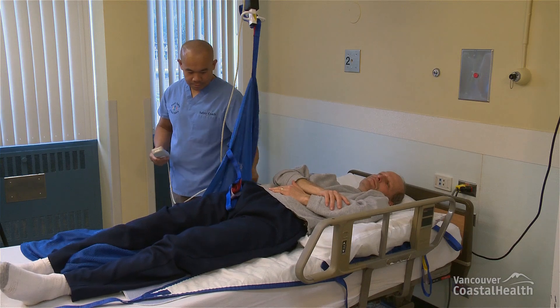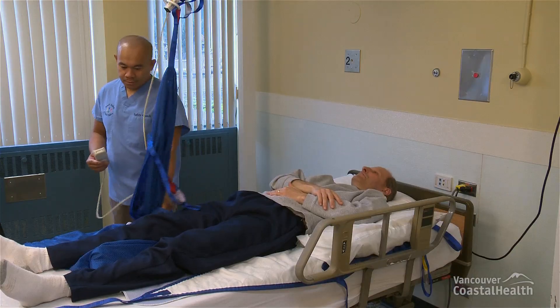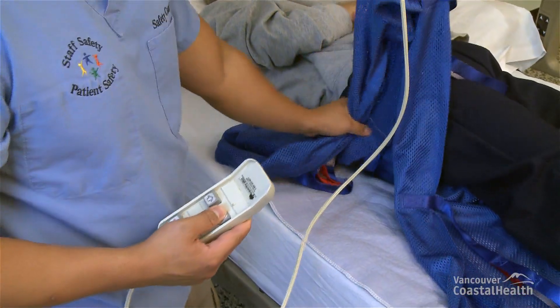Starting from the resident's head, gently pull the positioning sling from under the resident. If you have to pull too hard, slightly raise the lift's carry bar to assist with this process.